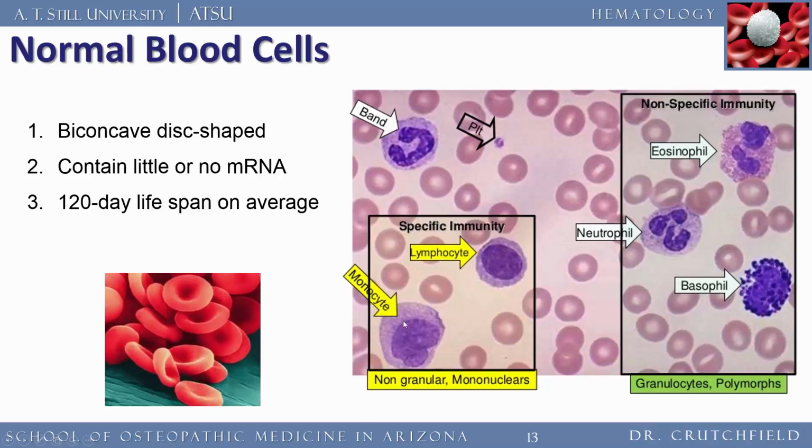We have a lymphocyte, we have monocytes, we have basophils. Notice the granules here. We have a neutrophil, which is a white blood cell. We have eosinophils with all these little granules that are getting ready to release histamine for our allergic reaction. And then a band cell is basically a premature neutrophil. So before these guys are born out into the circulation, they present as a band. Same thing, whereas a reticulocyte is a premature red cell, these bands are basically premature neutrophils.